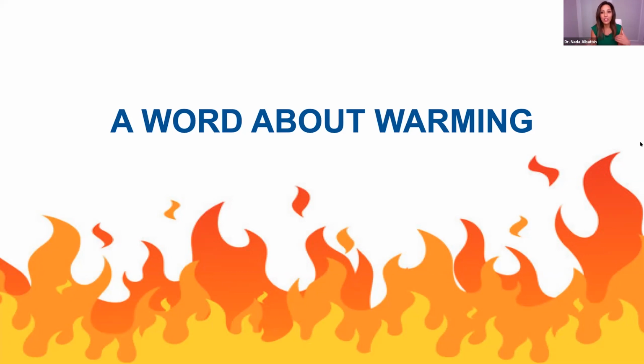What I'll tell you is it improves the handling of all composites I've ever warmed with a warmer, and it makes everything more flowable and all the composite goes everywhere that you want it to without you having to do too much to it. And I love that feeling because it makes me more efficient. In the worst case scenario, based on the literature, when you warm your composite, the physical properties don't change. In the best case scenario, the physical properties improve. So to me, this is a win-win-win situation.